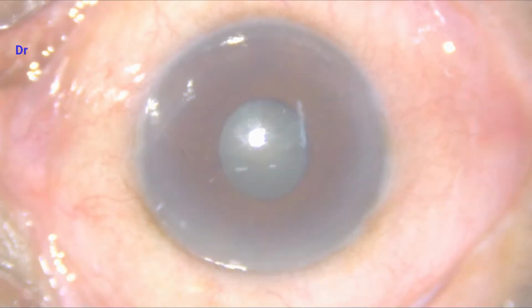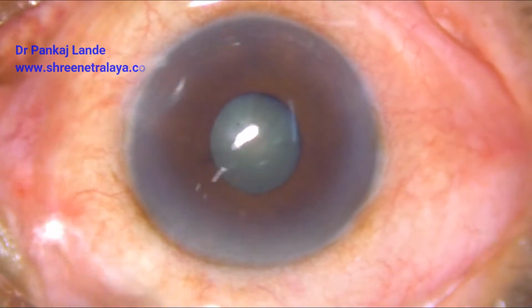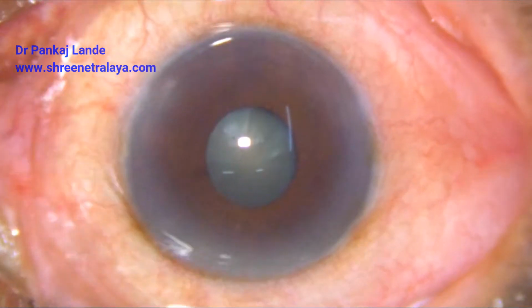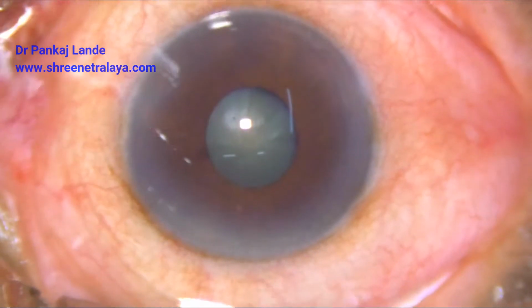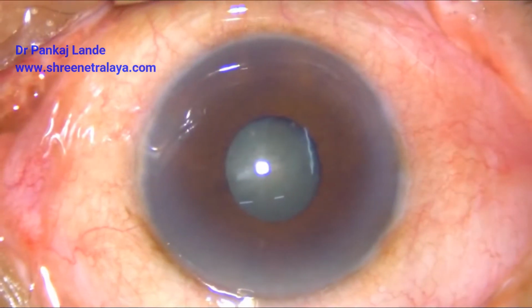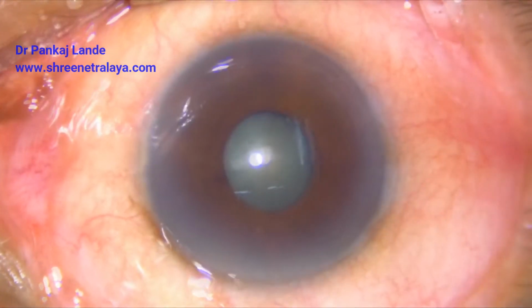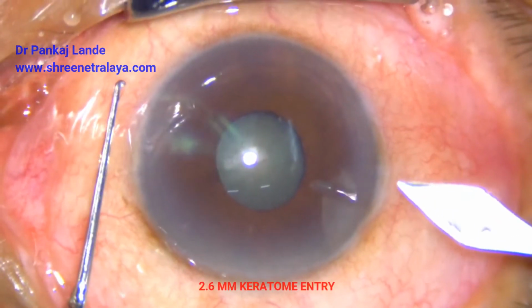Hello there. Today I am going to show you one case of small pupil and a few tips on how to manage it. As you can see here, the pupil size is quite small, around 3 millimeters, and otherwise the cataract is grade 2.